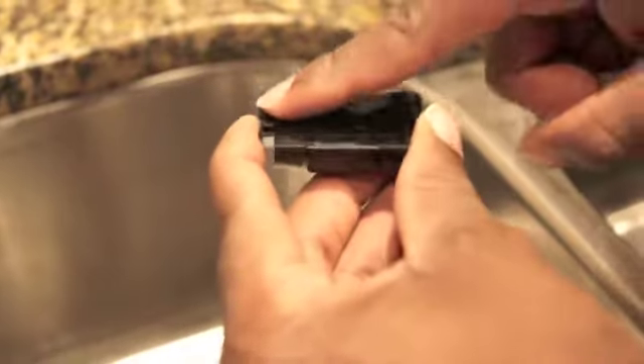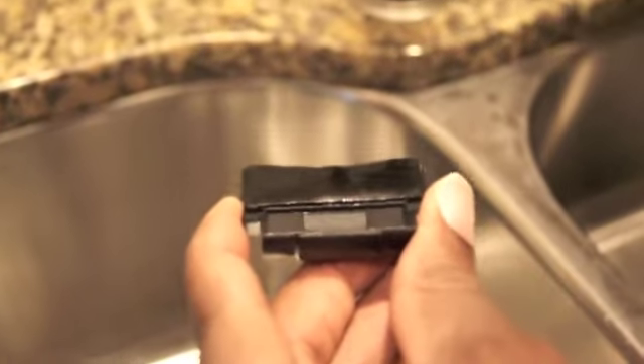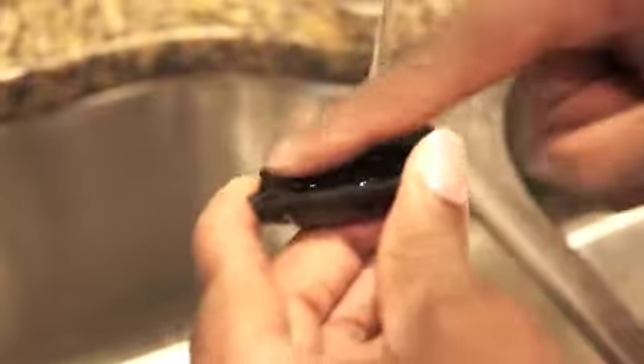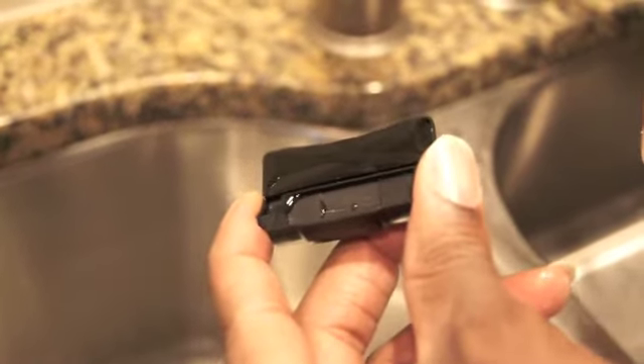Over time, dirt and debris will gather on the surface of your pad. To clean, simply run some water over the pad and use your finger to remove any dirt and debris. Once you're done, simply leave the pad to dry and it's ready to use again.